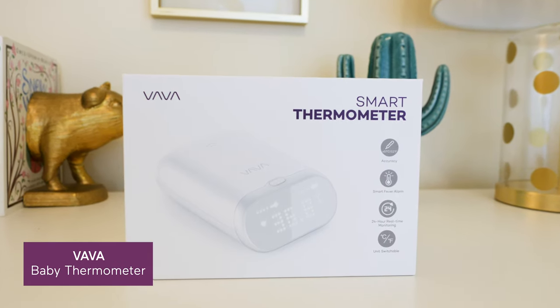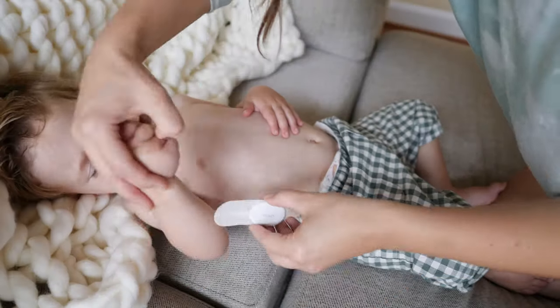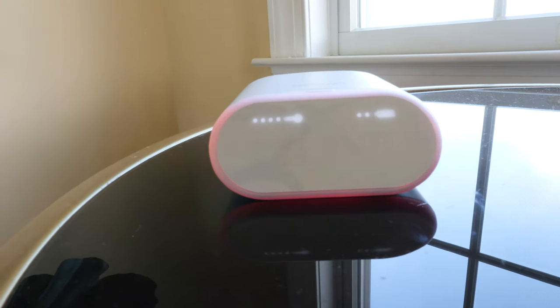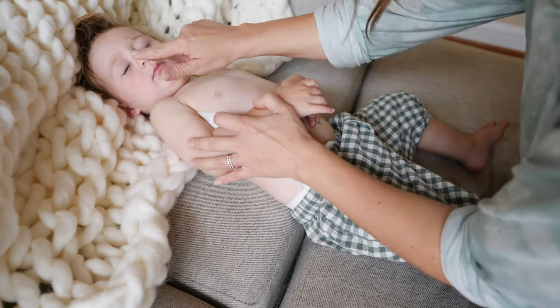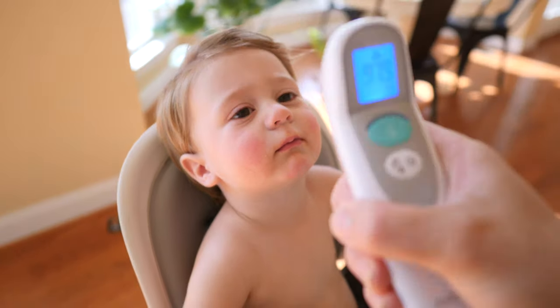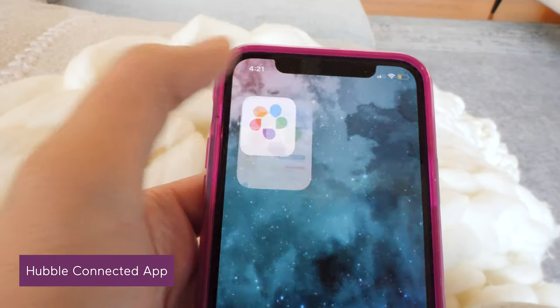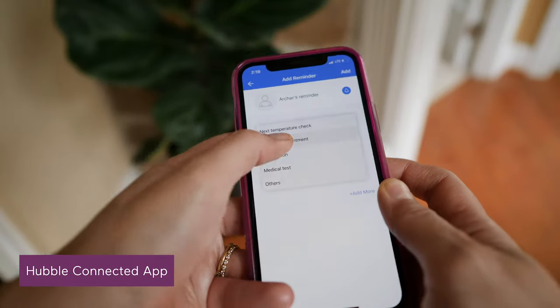The VAVA baby thermometer monitors temperature through a wireless patch made of skin-friendly silicone that is attached to your baby's armpit and displays the reading on an LCD screen. It alerts you with real-time beeps and a blinking LED light the moment it detects a high temperature. The patch holds its charge for 24 hours and only takes an hour and a half to recharge. Lastly, the Motorola 3-in-1 smart non-contact baby thermometer measures temperatures within an inch in less than a second and can also take temperature readings of foods and liquids. Where this forehead thermometer really stands out is when it's paired with the Hubble app, which can track temp history, monitor fevers over time, share readings, set medicine alarms, log symptoms, and more.